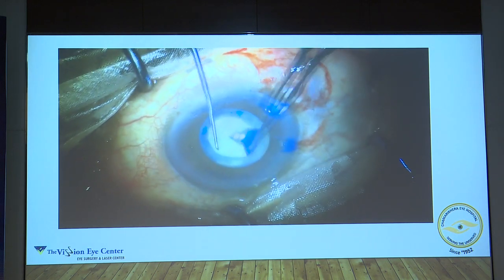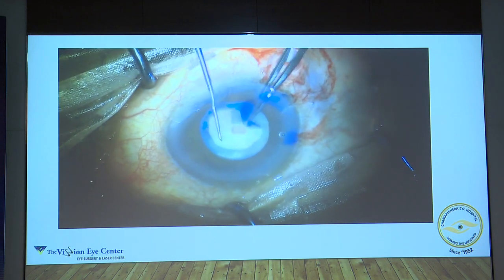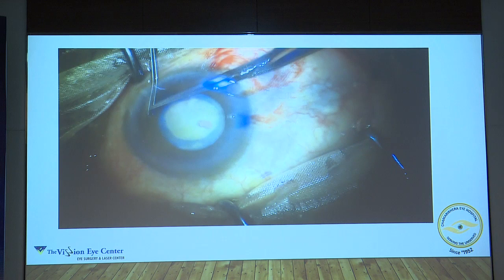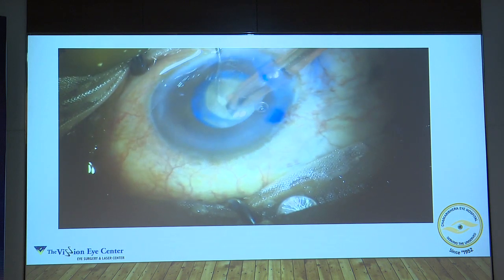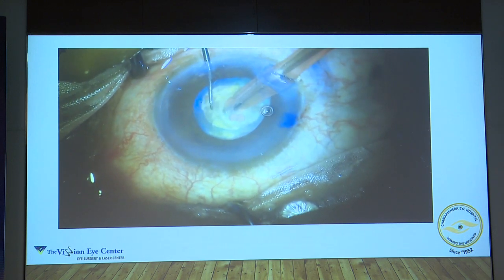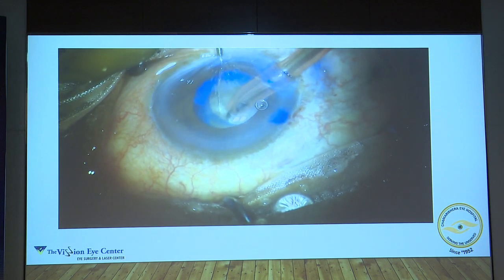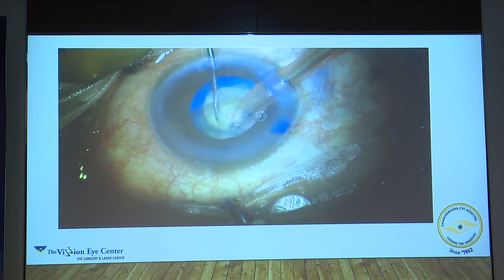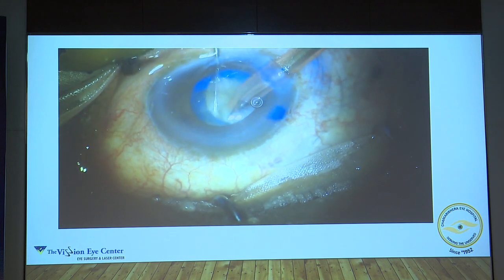At this point your vector has to be correct, because it's very easy to take the rhexis out. The vector has to be correct — only then will you get a circular rhexis; that is the point at the end when the rhexis most often runs off. In this case, you can see that once you are embedding the tip, the chamber is getting shallow — you will see a lot of striae on the cornea. The reason is that the chamber is shallowing because the side port is not calibrated and a lot of fluid is escaping from it.